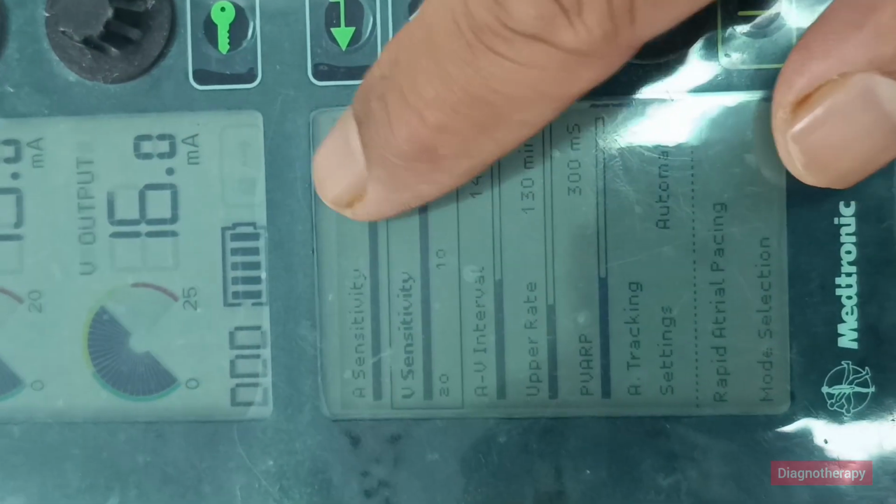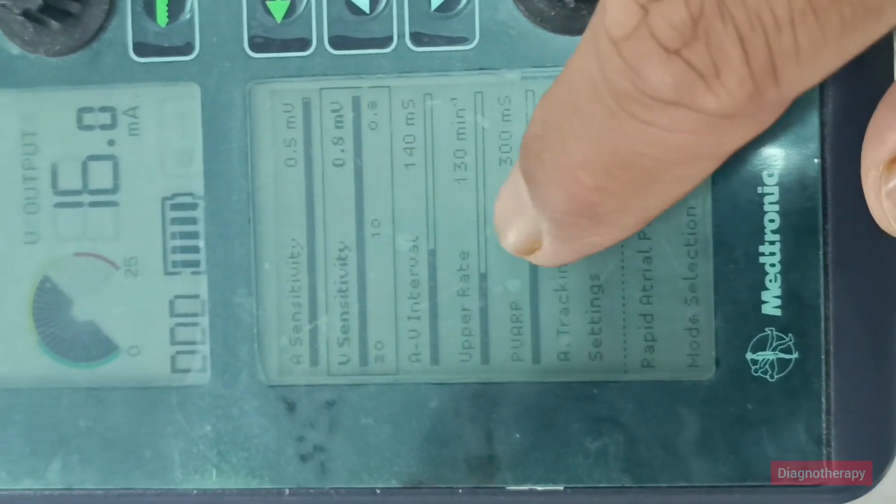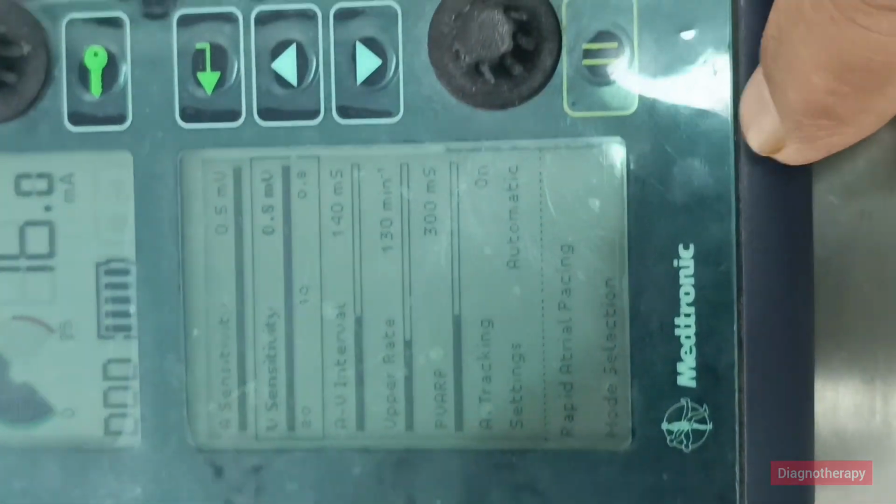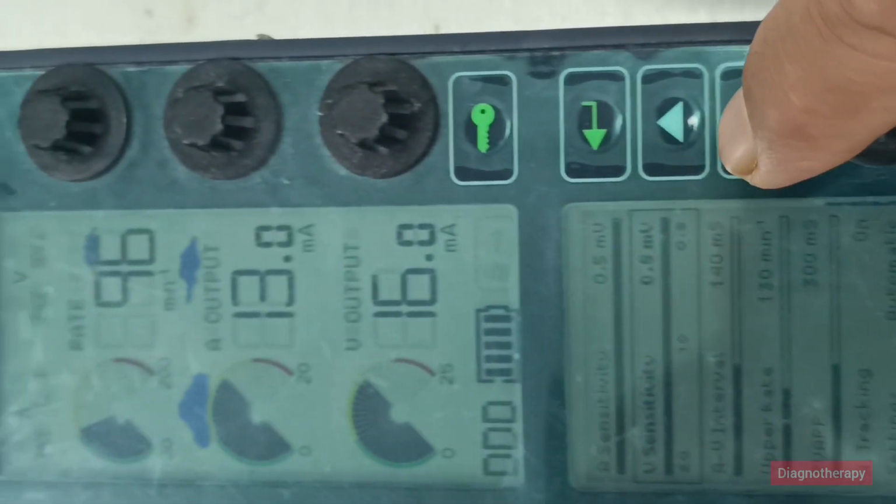So all the keys will be logged if that key is pressed, and these values which you are seeing will be logged. Whereas on the right side you will get all the controls, and on the left side all the display parameters.